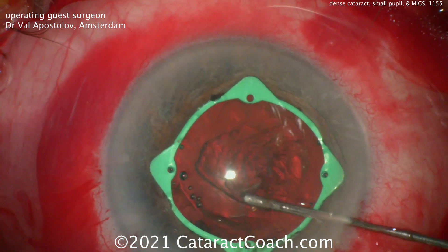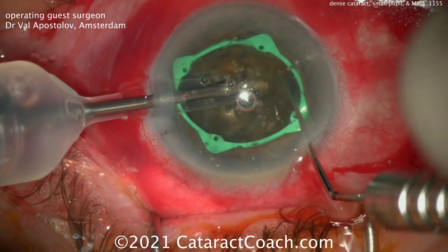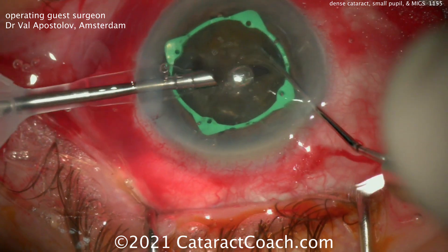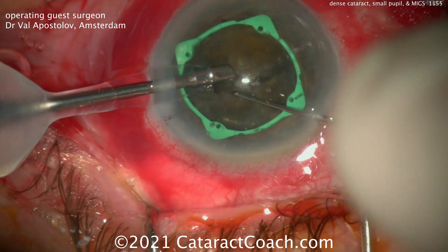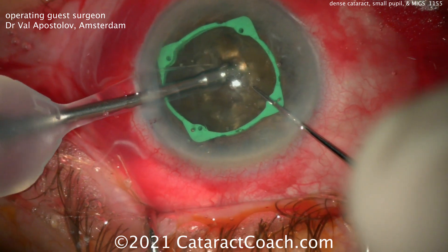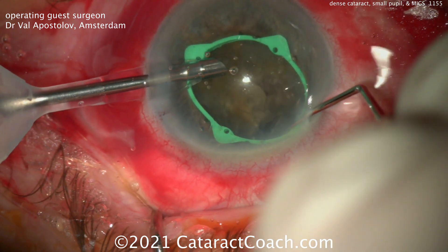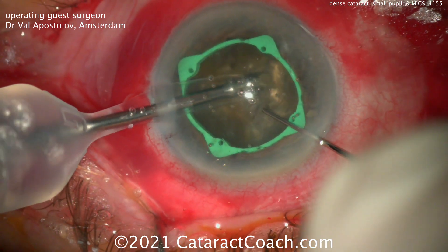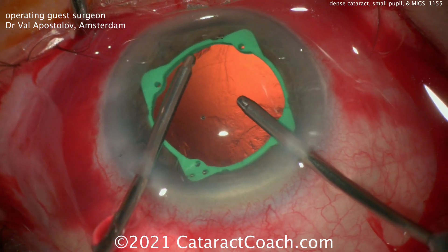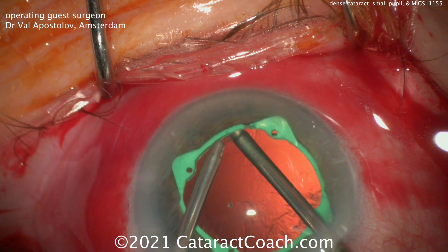You need sufficient access to this dense cataract. Remember, the lens nucleus does increase in size as you get more nuclear sclerotic changes over time — it can increase in its actual dimensions. Now he's chopping in the bag, and wow, that has some density to it. Got a good split there, propagating all the way through. Looks like he has a temporal incision but is sitting superiorly. Notice the angle between the phaco probe and the paracentesis side is about 120 degrees apart. The challenge here is you've got to operate within the small confine of the pupil expansion ring. This patient is likely a hyperope too, probably with a shallower anterior chamber. He's just taking his time, cleaning out the cataract.